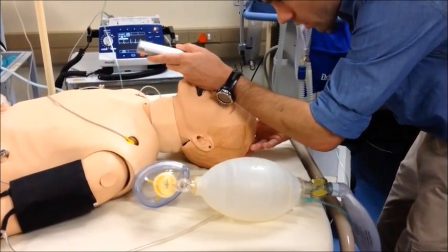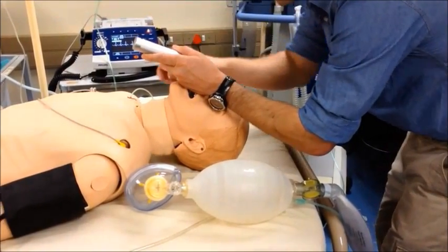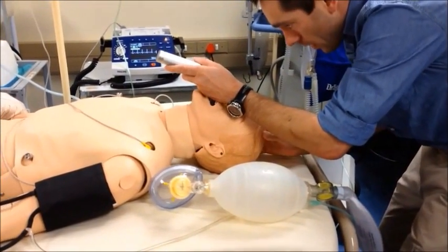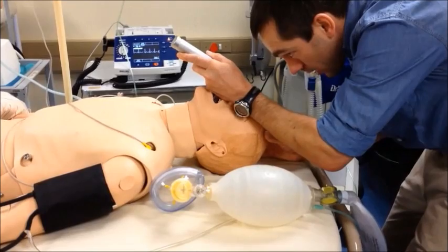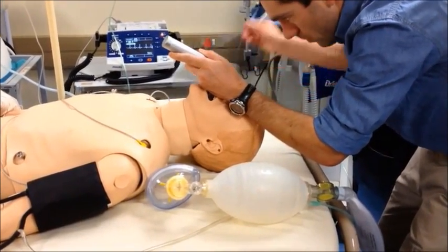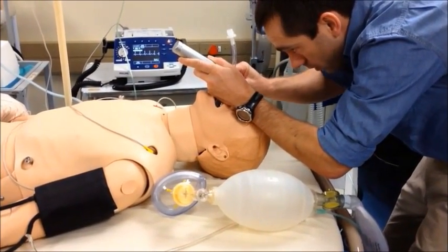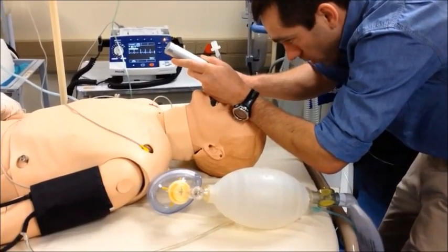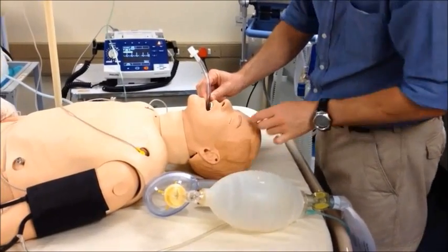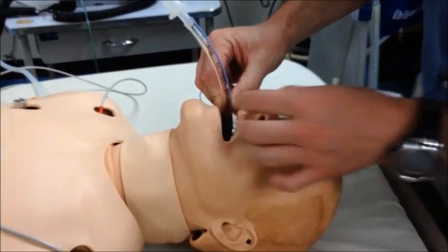Gently advance the laryngoscope blade along the tongue, pulling in the direction of the handle, taking care not to tilt. As you advance and pull the tongue up, you'll visualize the vocal cords. Remove the ET tube from the sterile packing. Advance it into the mouth and through the vocal cords, the vocal cord markers lying between the tube's vocal cord markers. Remove your laryngoscope and note the depth of insertion — 22 cm at the front teeth in this case.